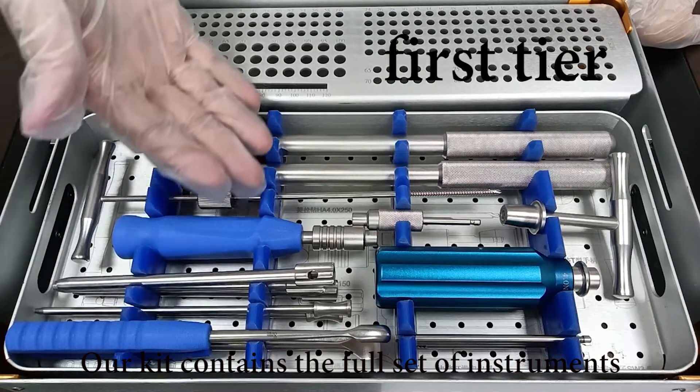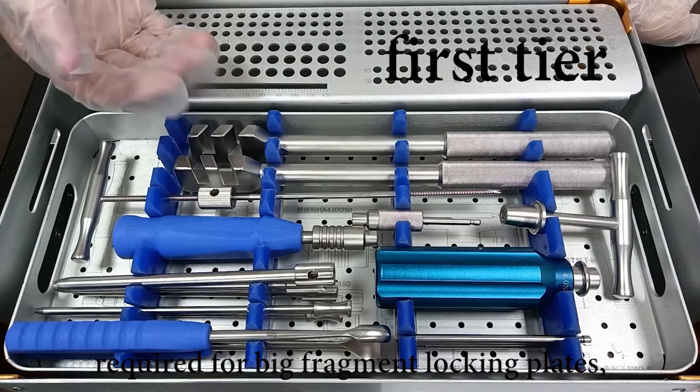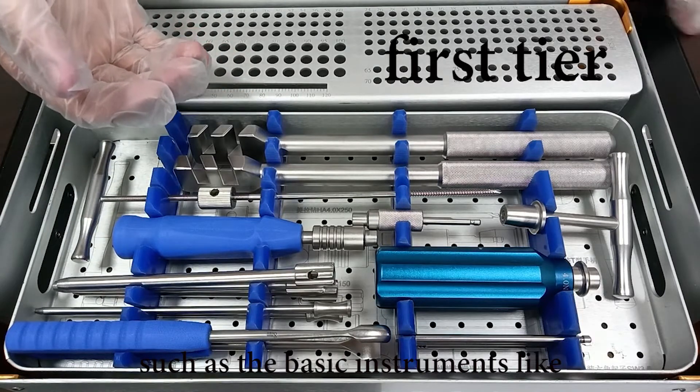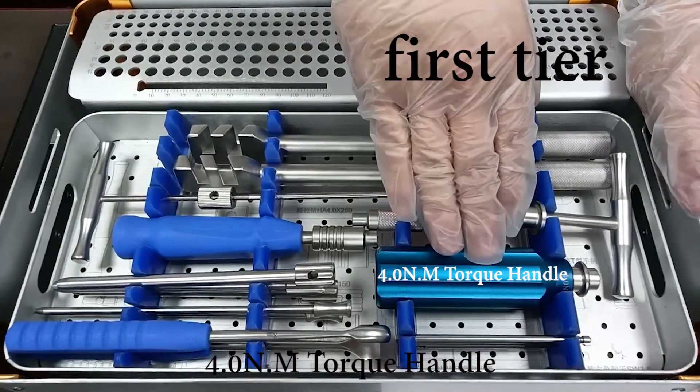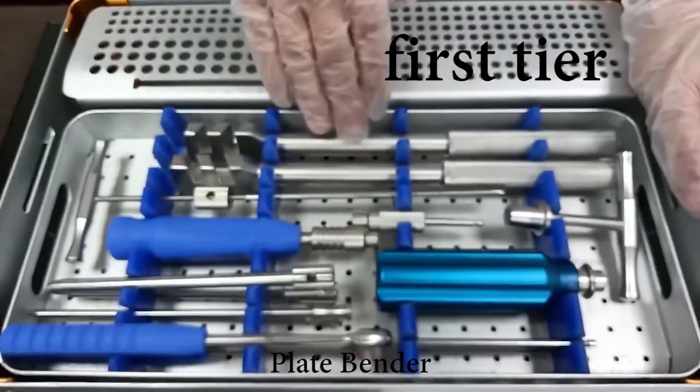Our kit contains the full set of instruments required for big fragment locking plates, such as basic instruments like straight quick coupling handle, 4.0 Nm torque handle, and plate bender.